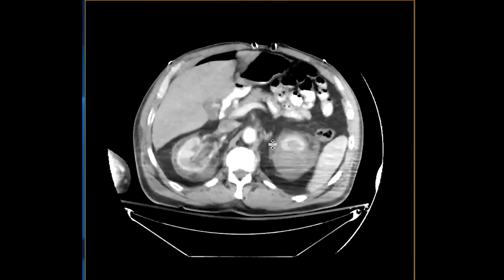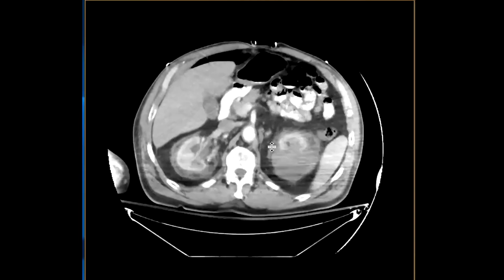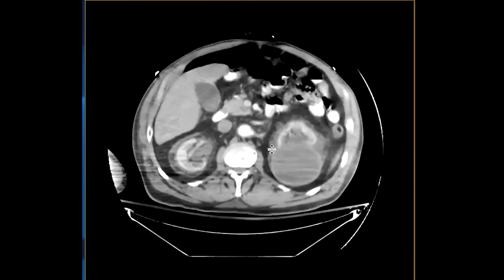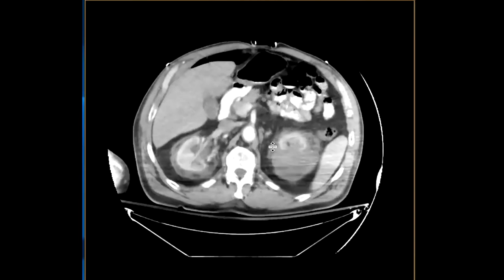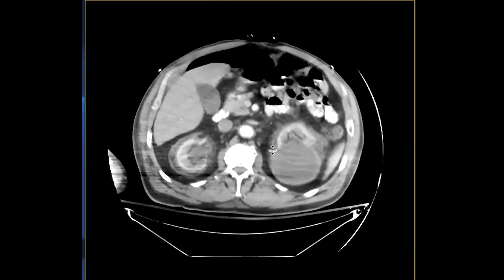Another entity to think about, which is really, really rare, but which when it does occur likes to involve the retroperitoneum — and this is what this case turned out to be — is Erdheim-Chester disease. Erdheim-Chester disease is a non-Langerhans cell histiocytosis.